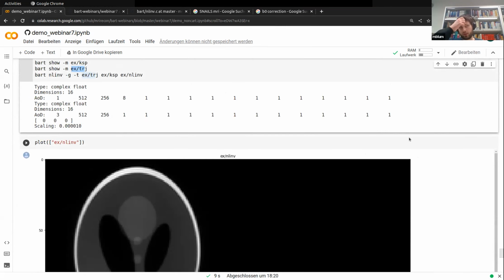So if you want, you can now try to do that more efficiently by shifting and changing the field of view, or we use the remaining half hour for question and answer, of course.